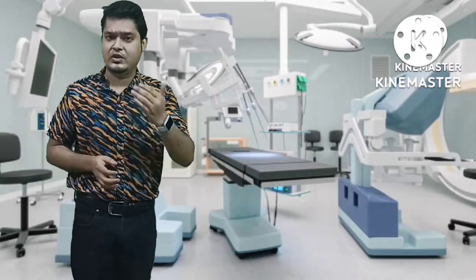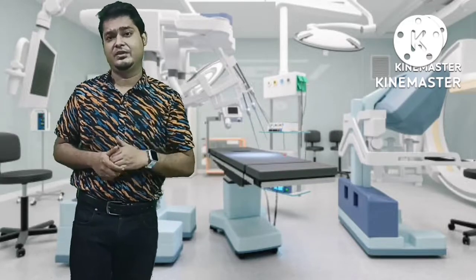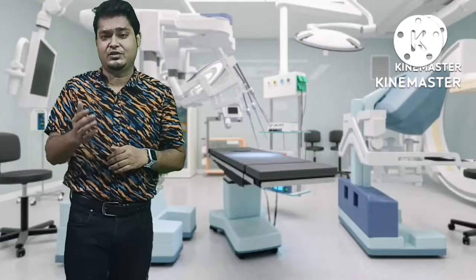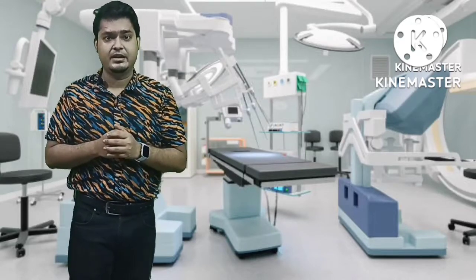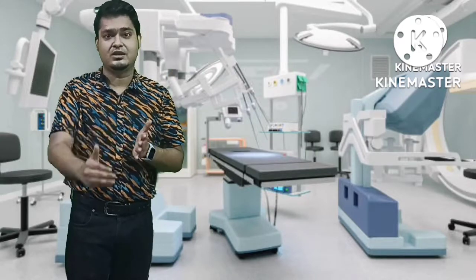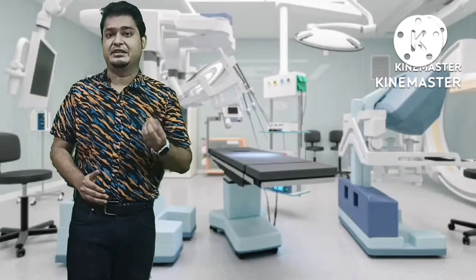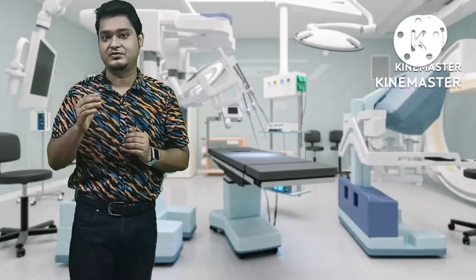Also, the resolution of the images acquired in the traditional catheter angiography is higher as compared to the resolution of images acquired in the CT coronary angiography. Okay, and the most important advantage of catheter angiography is that we can treat after detecting the blockage, but in CT scan we can only detect, we cannot treat it.